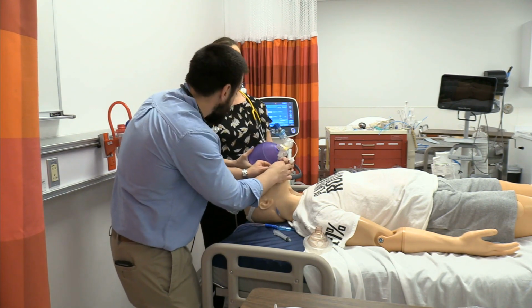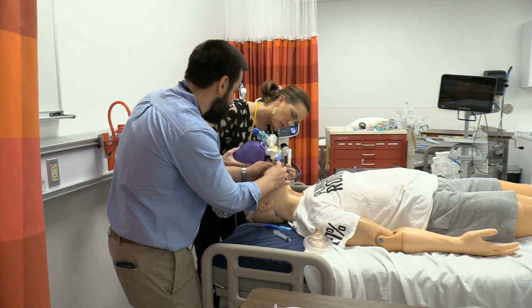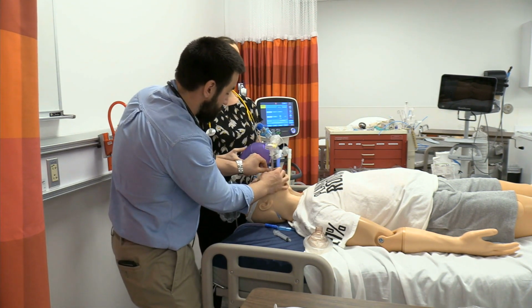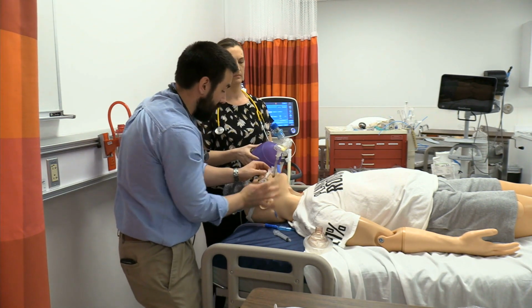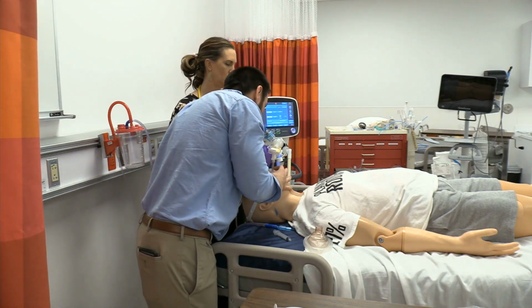All right, I got the tube. I can't see the markings. Just make sure I'm not moving around. We still have about 23 at the teeth. 23 at the teeth. So there'd be an adhesive pad right there. I'm going to wrap that around the tube really firmly. Push until it clicks. All right. So make sure we're still good here.